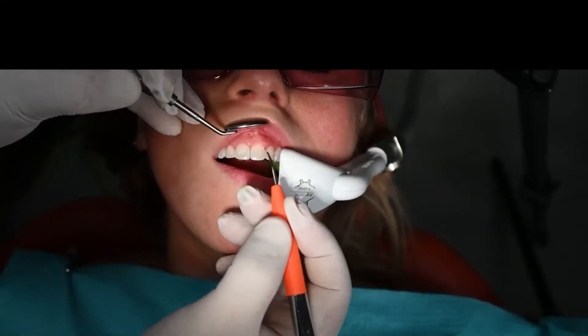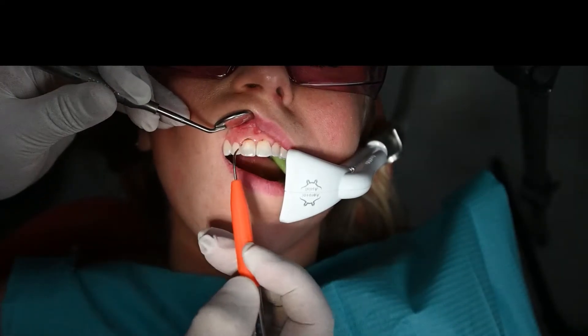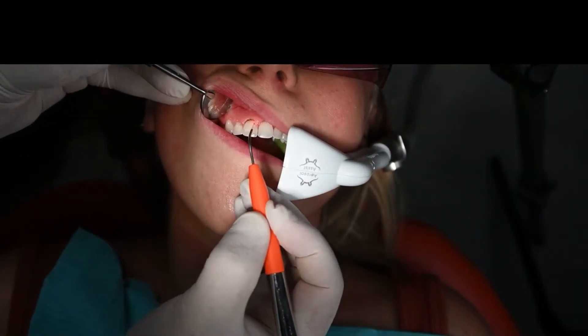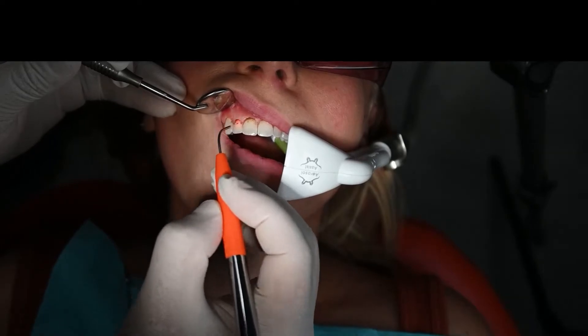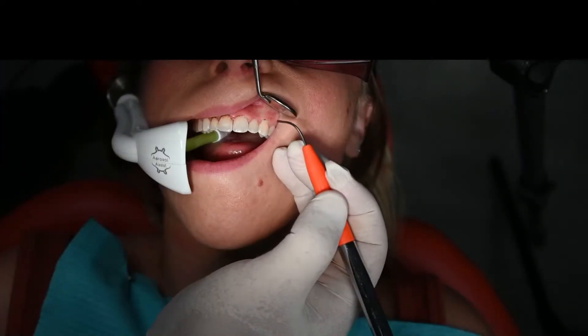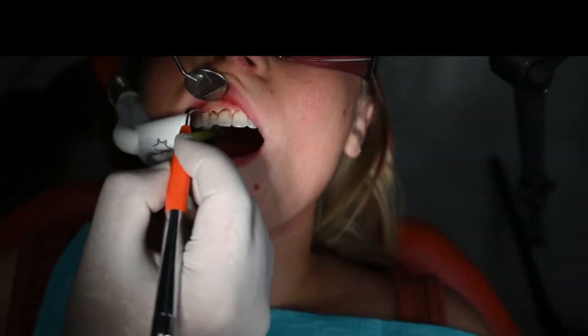The Picasso diode laser with a 400 micron tip is activated and the selected gingiva is removed. Picasso diode lasers are affordable and are perfect for this procedure. The gingival architecture and zenith were analyzed before the procedure and are then listed by each tooth that will be altered, with the measurements of reduction written next to them.